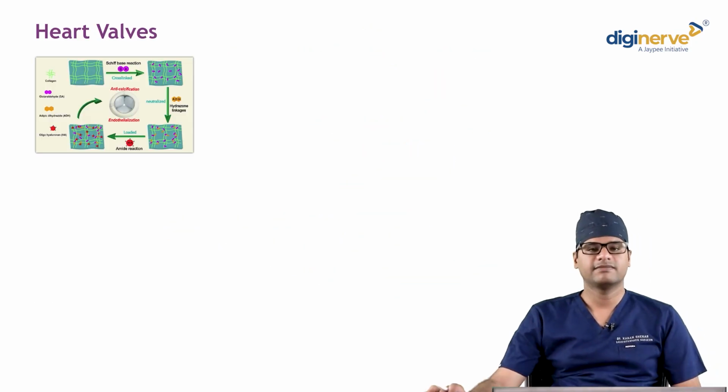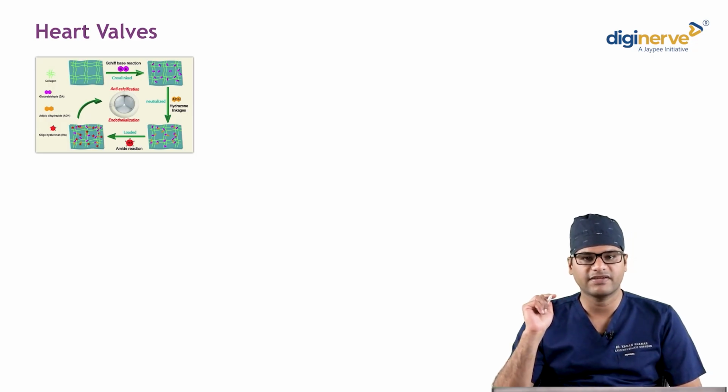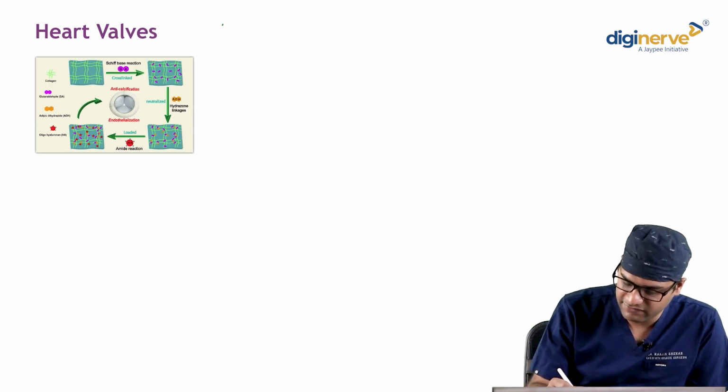All of these heart valves, both these heart valves, are subjected to a process called glutaraldehyde fixation. Now this glutaraldehyde treatment is essential for heart valve fixation. Why?